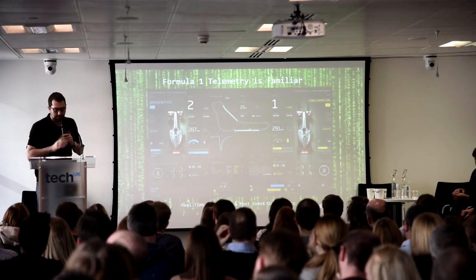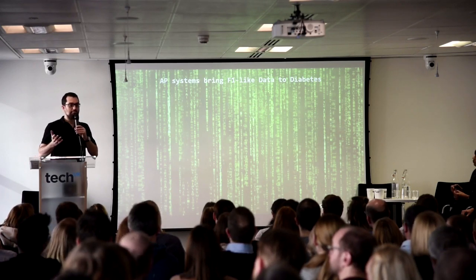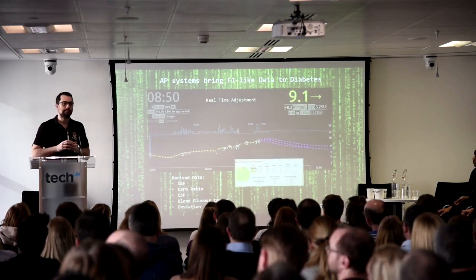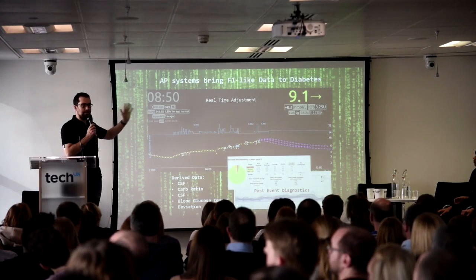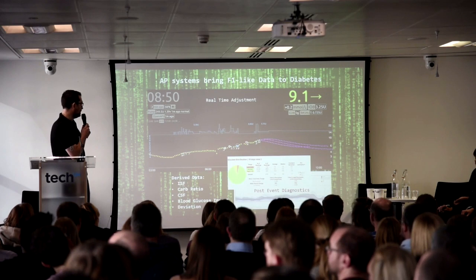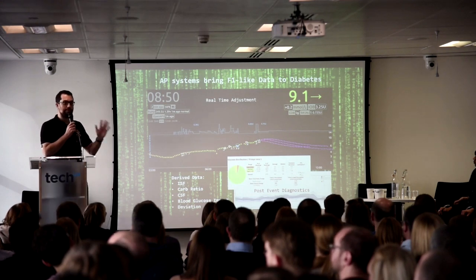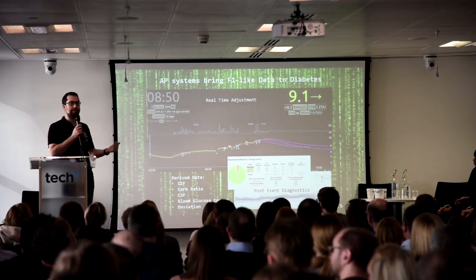Artificial pancreas systems have similar capabilities. You've got F1-like data available to you. What do I mean? If I show you that, you've got the real-time data, the Nightscout traces that we've all been showing. Again, not quite such a flat line in that image, but it's not too bad. But then we've also got the post-event diagnostics. And what Nightscout doesn't necessarily show you is the derived data that we generate from all of this stuff.